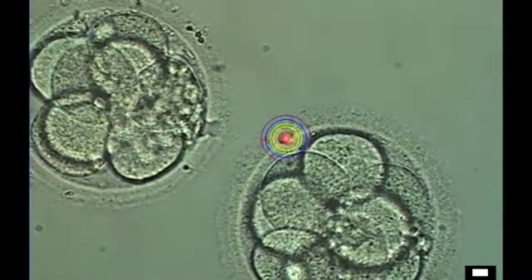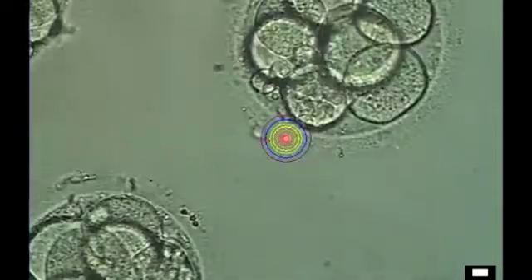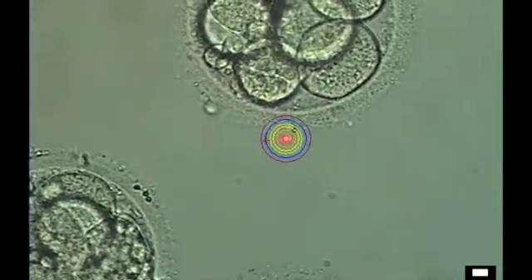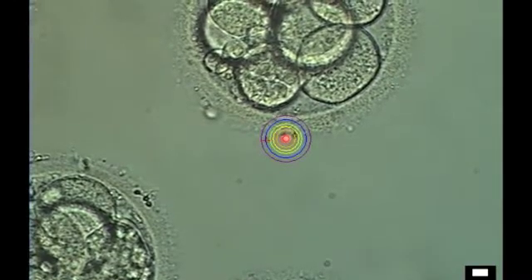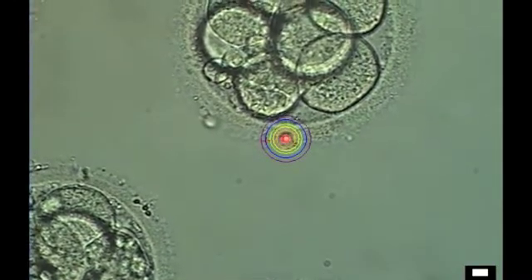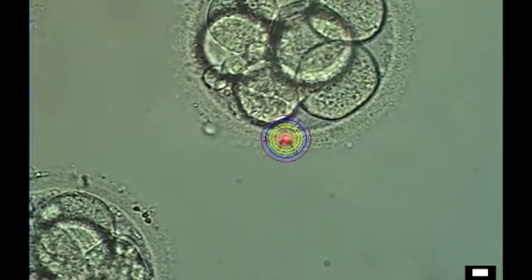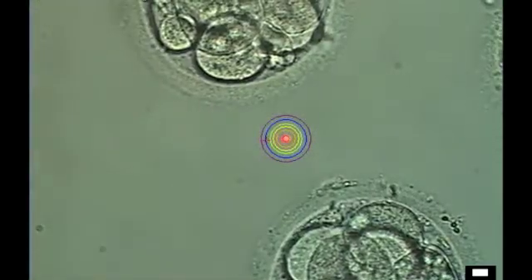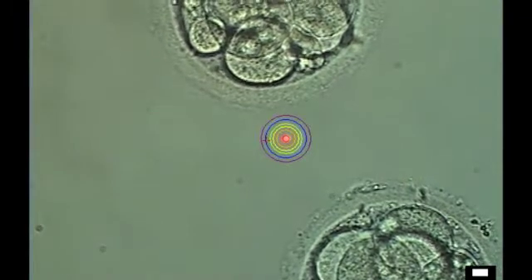It's cutting a slit through the eggshell, or zona, which will allow these embryos, as they continue in their development, to escape out of the eggshell, which they must do to implant into the endometrial lining of the uterus to establish a pregnancy.